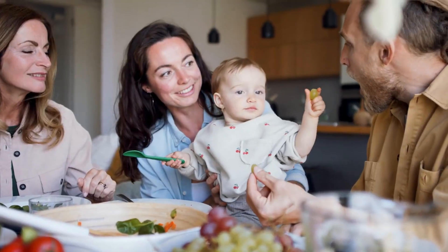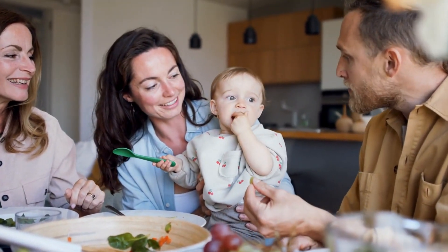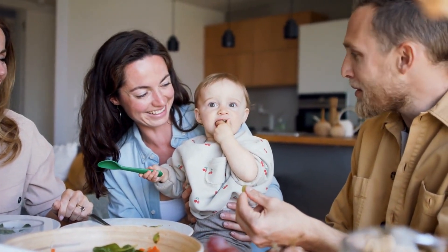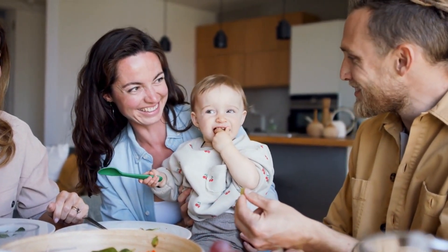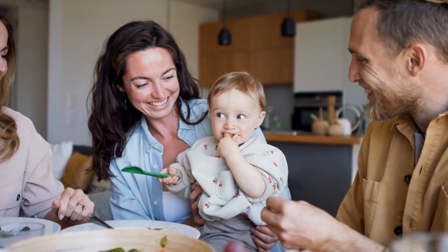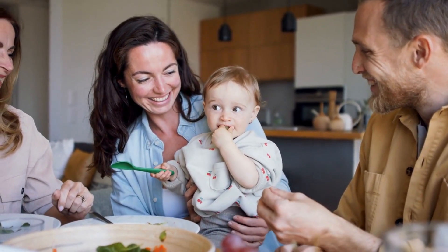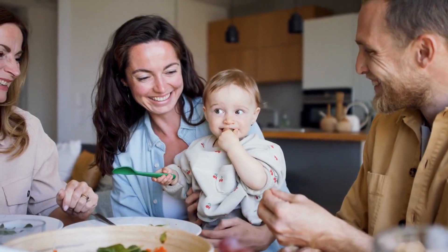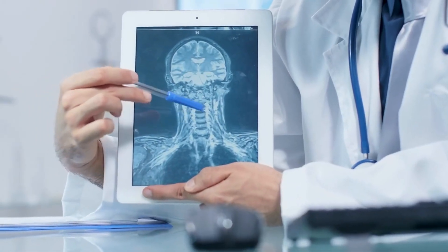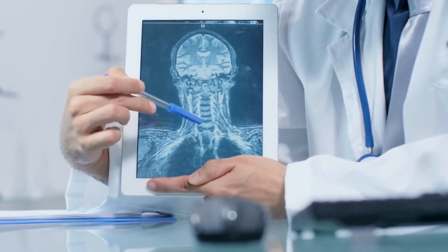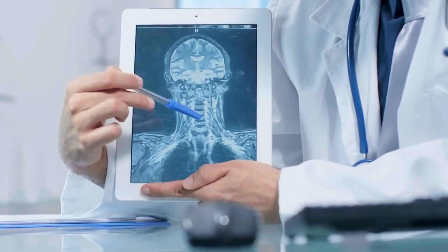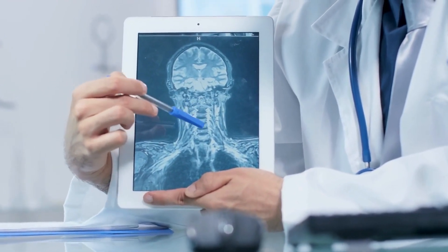Transcarotid artery revascularization offers a less invasive alternative to traditional carotid endarterectomy, particularly for patients deemed high risk for standard surgical procedures. Here's a detailed overview of how transcarotid artery revascularization is performed by a vascular surgeon.